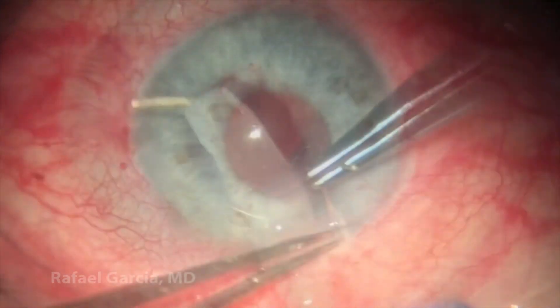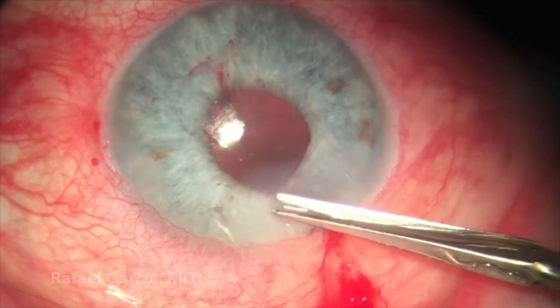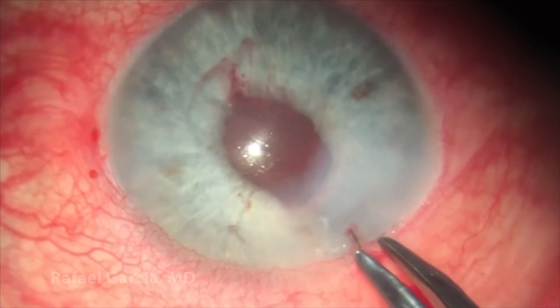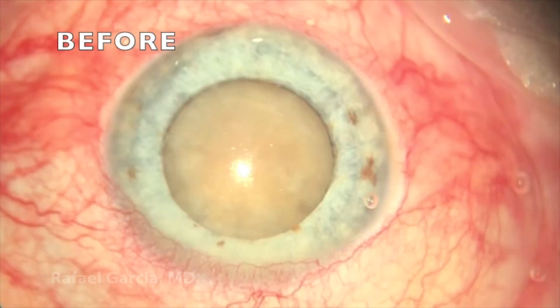Finally, we put a 10-0 nylon suture in the main corneal incision just to make sure there won't be any leakage postop. The knot is rotated, an air bubble is injected in the anterior chamber, and now this floppy iris case is concluded.